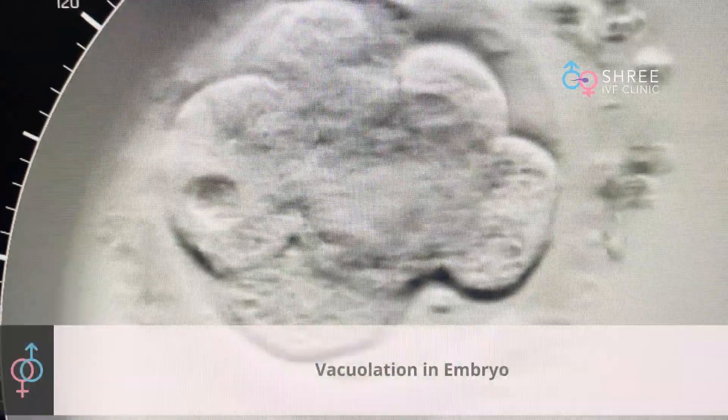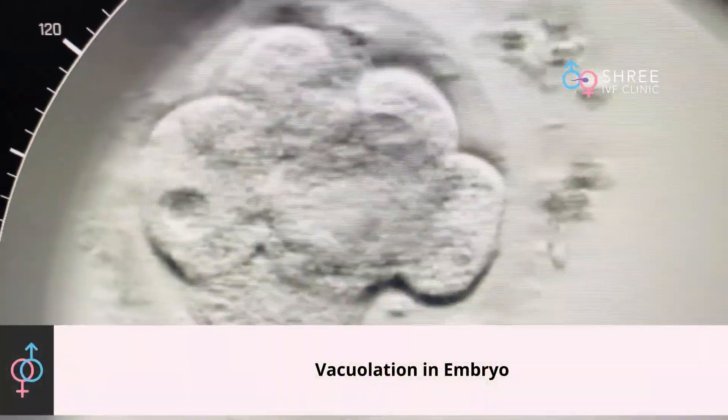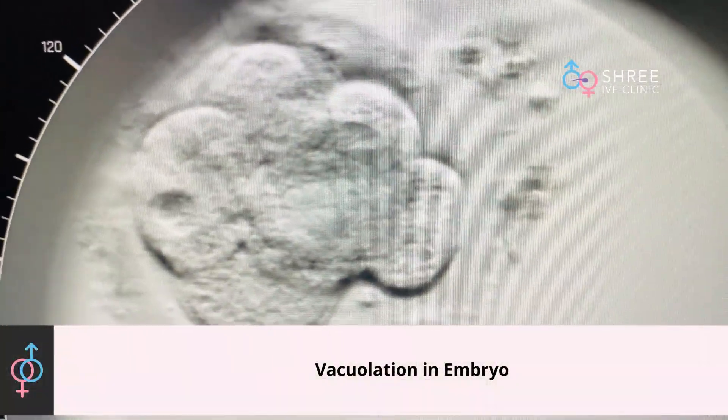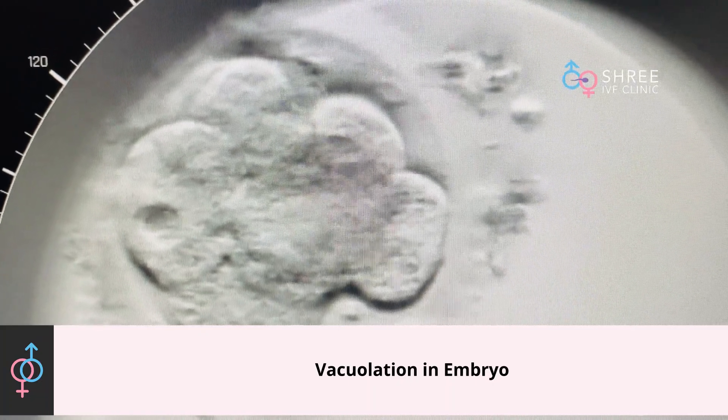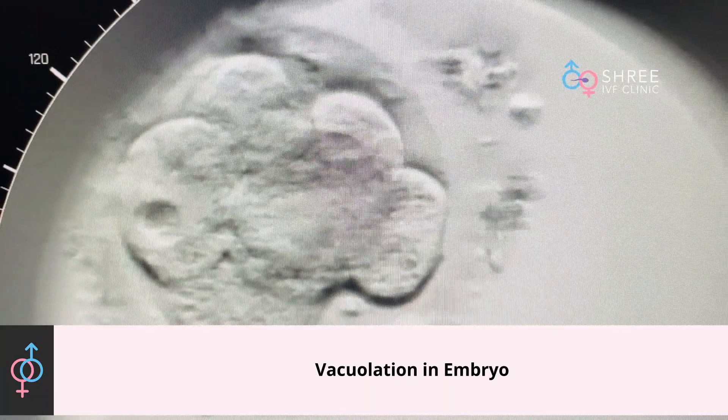This embryo looks good, but if you see in between there is a little hole inside it. This is called vacuolation inside an embryo. So I will not rate this embryo as one of the best embryos out of what this patient has.